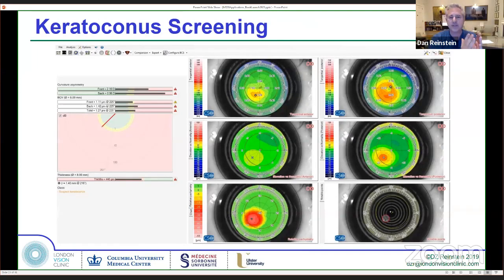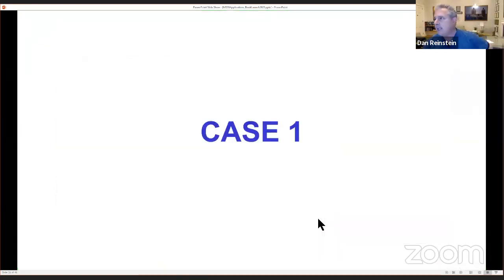Not to mention that Francesco's keratoconus screening is actually very good at picking up normals when, for example, a Pentacam says it's abnormal. So the D value and the Belin-Ambrosio plots can be quite off-putting. And then you go to corneal wavefront based analysis and you find that in fact it's deemed as normal. So I think it's very useful in that sense to be able to protect yourself against over-enthusiastic diagnoses of keratoconus when there isn't. Now, let me show you some cases.